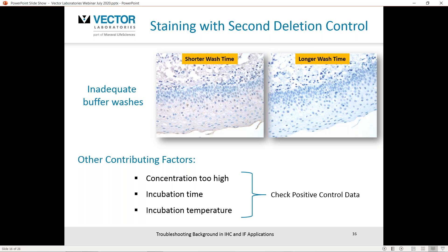Don't skimp on buffer washes. Take the extra time — it's easy to skip them when you need to race out to lunch. On thin cut sections of 4 to 6 microns, use two times 5-minute buffer washes, particularly after using a polymer secondary detection reagent. If you're working with thicker tissues over 10 microns, floating sections, or whole mounts, you'll need to increase the frequency and duration of buffer washes to remove unbound material.